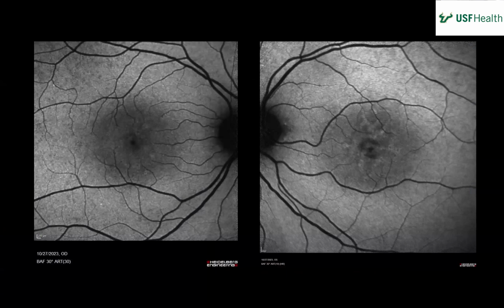So here we have a fundus autofluorescence of both eyes. You see some hyperpigmentation surrounding the fovea, and then you have this stippled hypoautofluorescence, more so on the left than on the right, but you see it on both. It corresponds to the lesions being a little bit more distributed on the left than on the right, more dense.